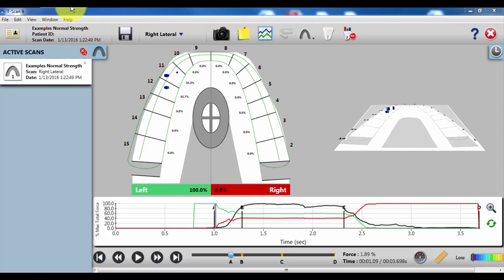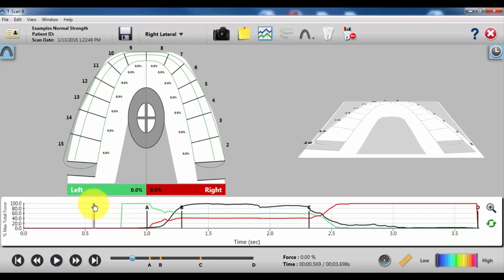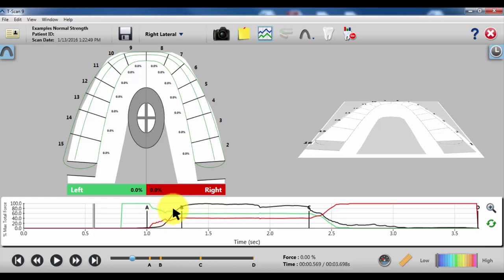As we talked about in the past, we'll click on the active scan to increase the size of the window. When we're looking for balancing a bite, we really only care about this A to B region, and this is where first contact occurs through the maximum intercuspation.